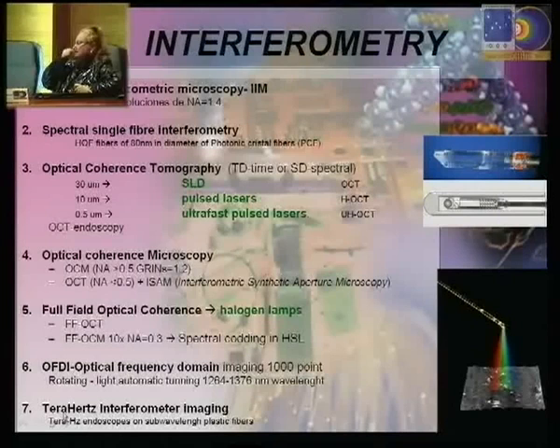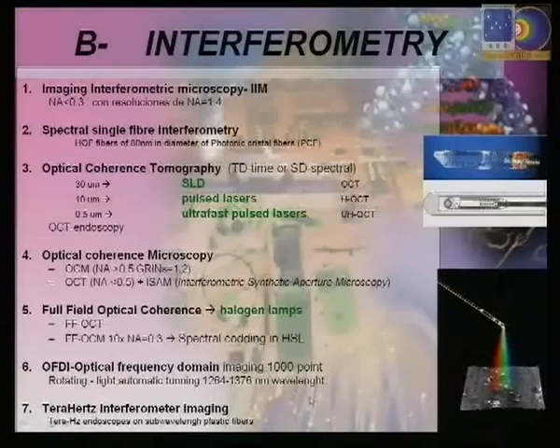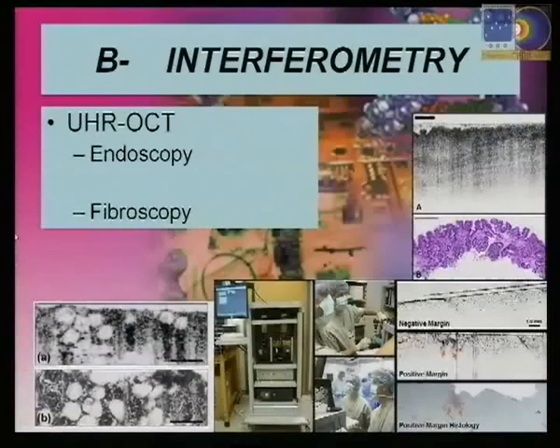And the latest system, which still has difficulties due to the lack of speed in order to obtain information from the interferometer imaging system, is the terahertz interferometer imaging.